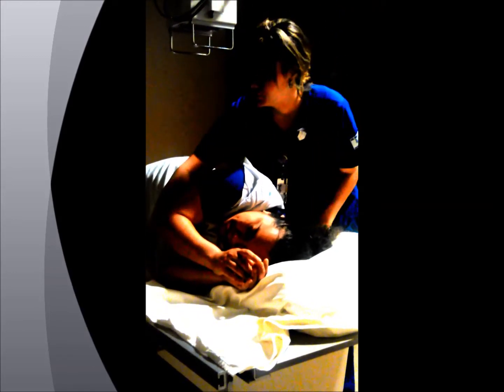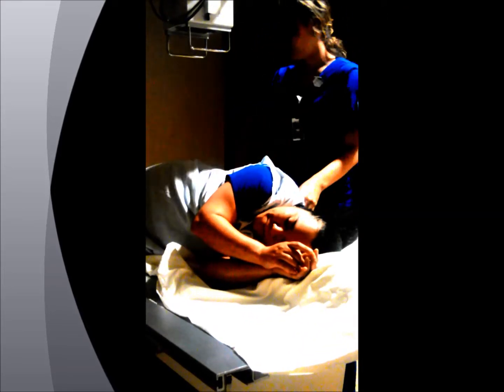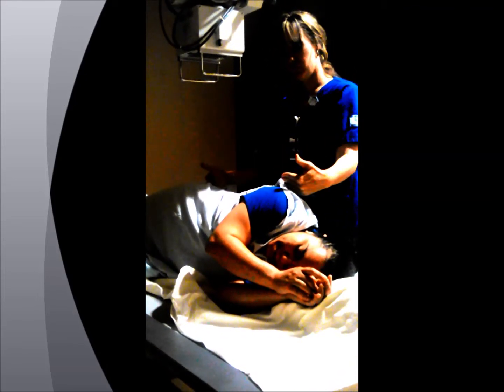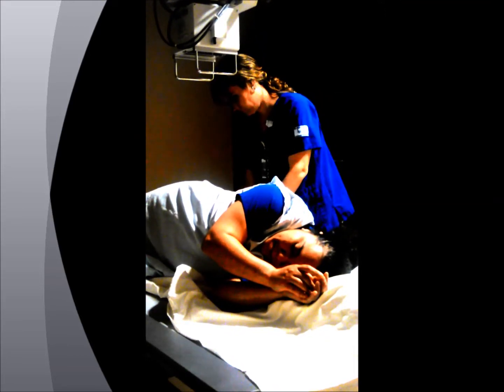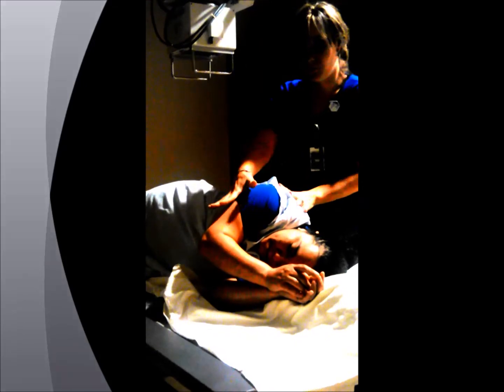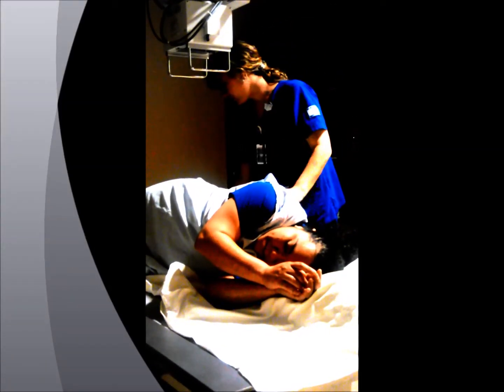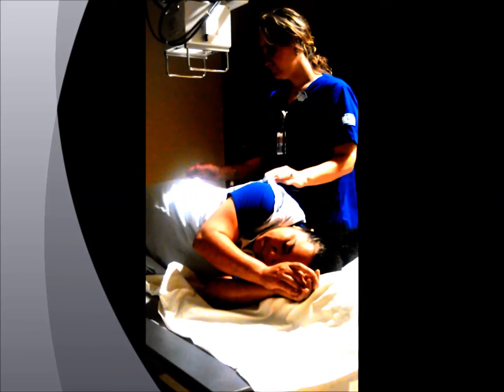And to make sure they're in a true lateral, you're going to bring them back, straighten up the spine, and make sure the hips and shoulder are parallel to each other. So the knees are bent, the arms are up in a praying position. You have the pillow under their head, and you're going to align mid-coronal.